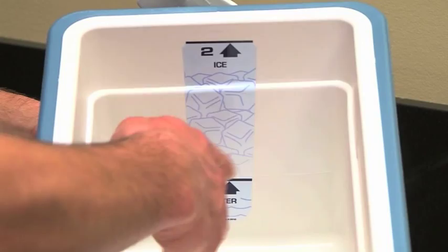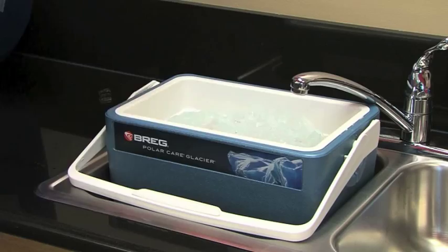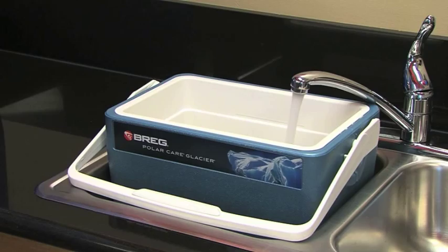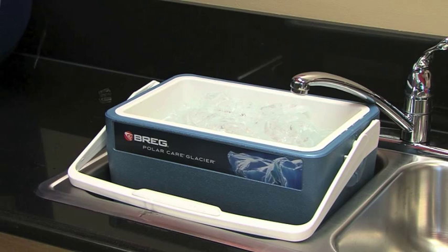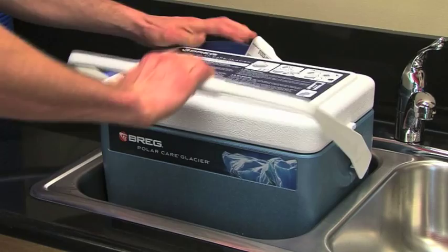Fill the unit with cold water, then ice – not the other way around – to ensure you maximize the ice time. Generally speaking, larger ice means longer ice time. Using the ice shown here, at its coolest setting, the water in the Glacier will stay under 55 degrees Fahrenheit for 10 to 13 hours. Once filled, place the lid on the Glacier with the hose pointed away from the product label.